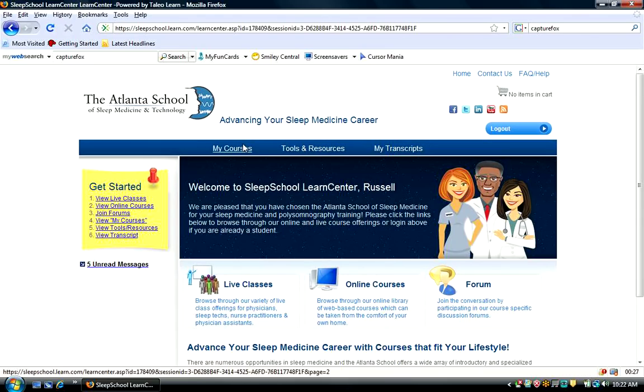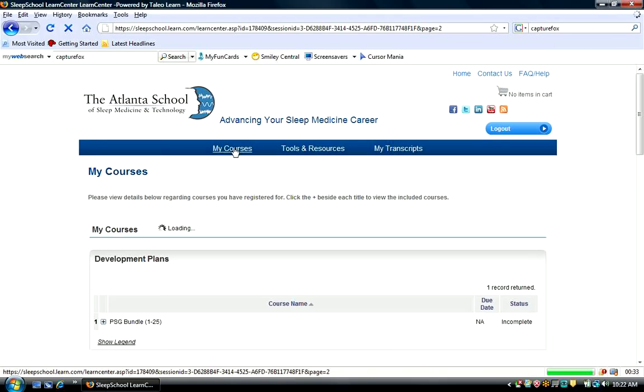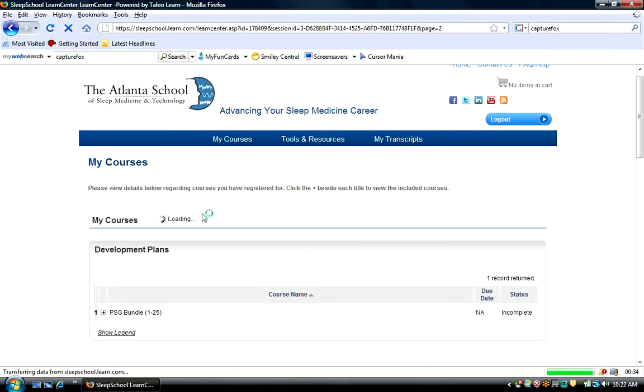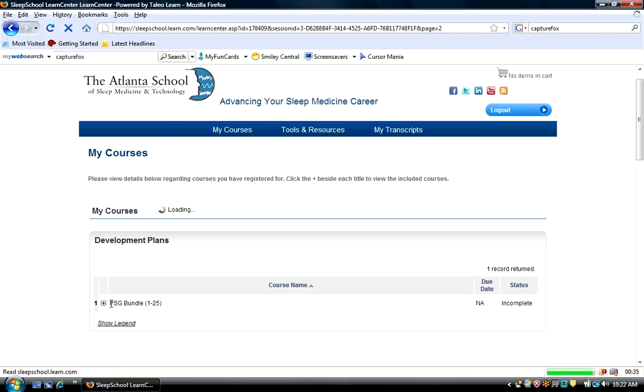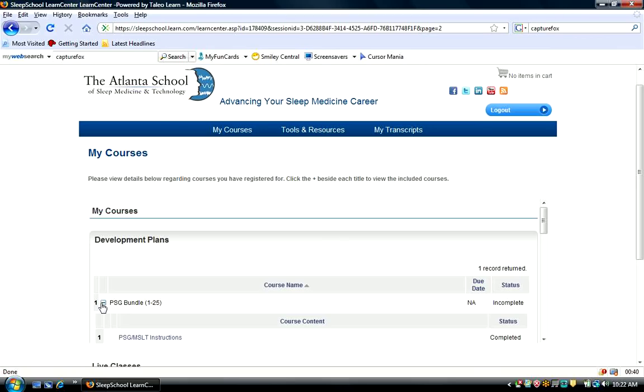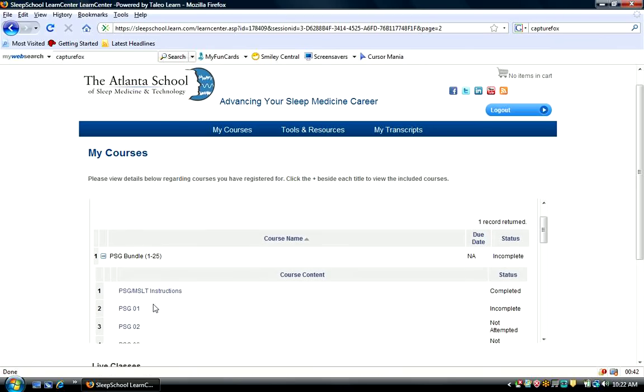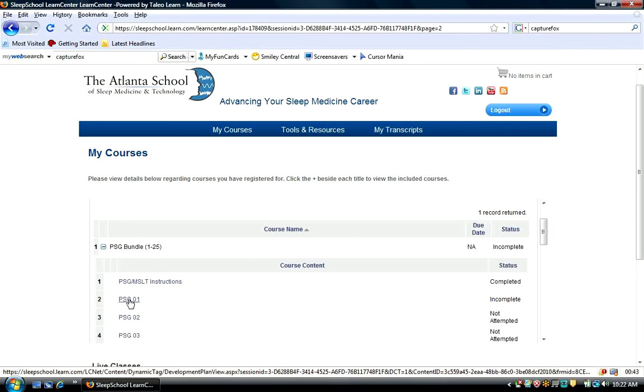From here, I'm going to click My Courses, and I'm going to click on the plus sign here under the PSG bundle 1 through 25. I'll scroll down here and go to the first PSG that I'm going to look at.